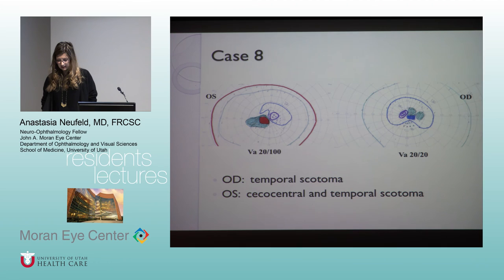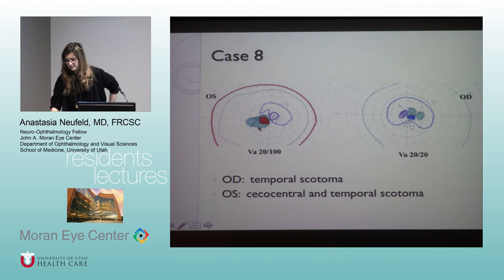So we did a Goldmann visual field, and if you look at this visual field, I really again want you to think about that flavor. Okay, so what is the general area these scotomas are in? They're temporal, exactly. So where is my mind going? Exactly. Say maybe that's an enlarged blind spot, but it's not really going around, it's going straight to the vertical midline there, and the same thing there.